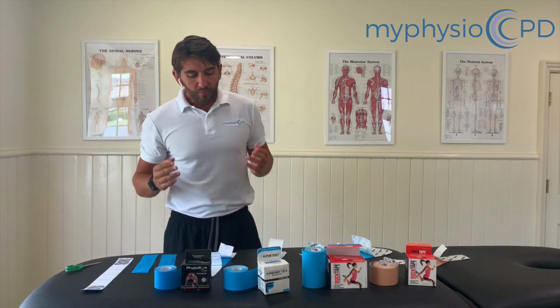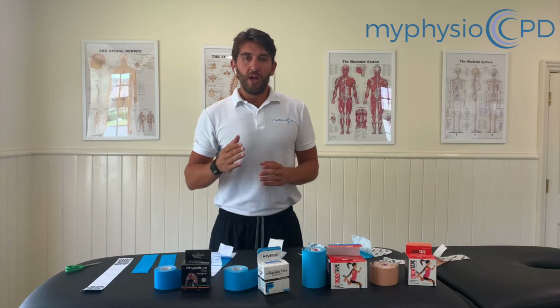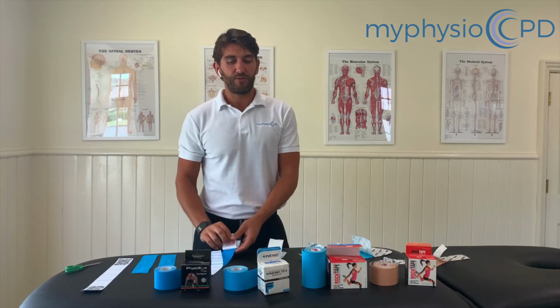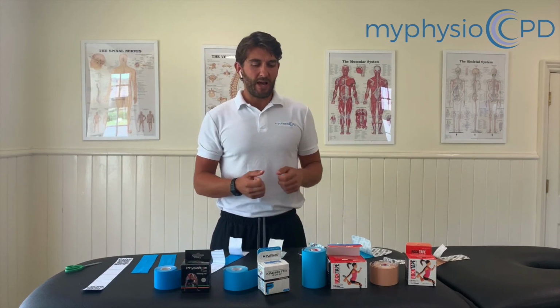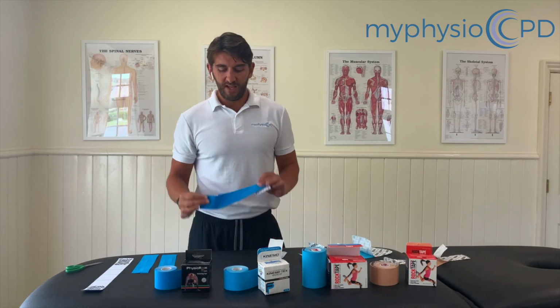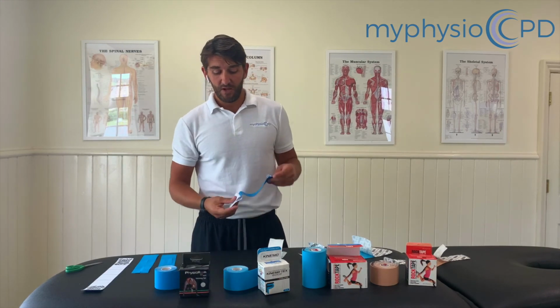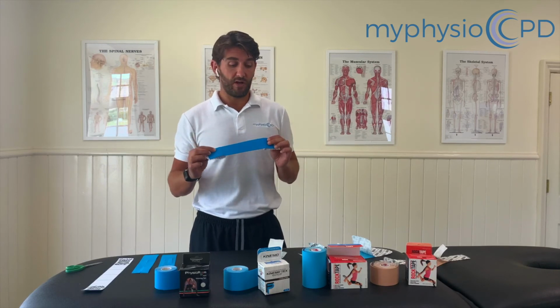So for me, with these different brands of tape and the pricing of them, and also the fact that we know that we're just getting a neurosensory stimulus from the tape, it doesn't really matter how robust it is and how much stretch there is on it, to be honest, because we're not getting any mechanical changes. So for me, the lowly, humble Physio Room own brand tape does just as good a job as all of the others. So this is the one that I use.